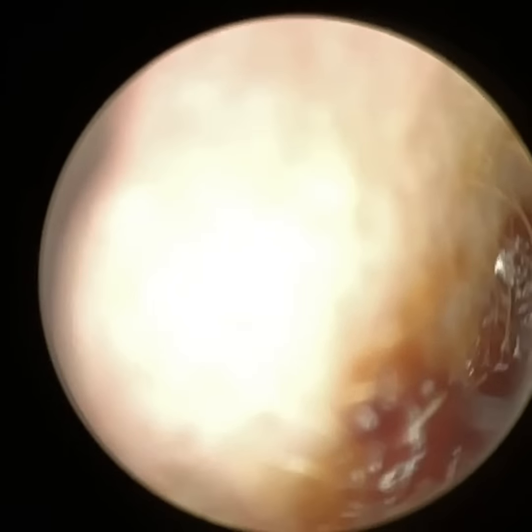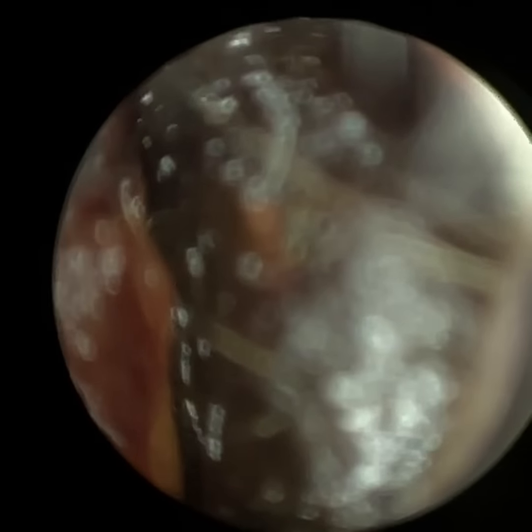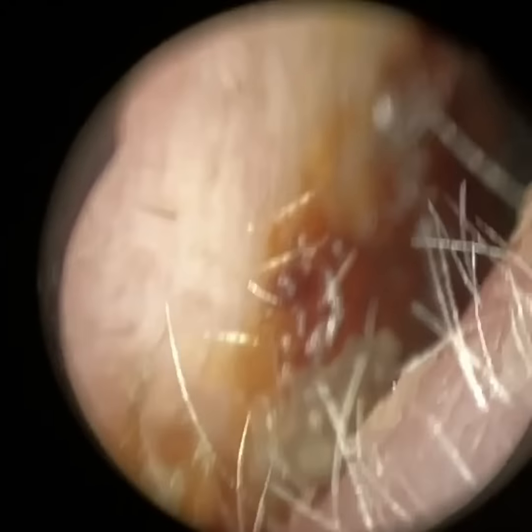Hi everyone, this is Neil Reiteter, consultant audiologist and director of Clearwax. Thank you for joining me in my latest video using the WaxScape.